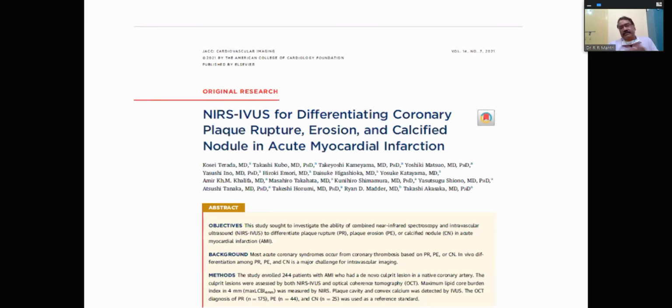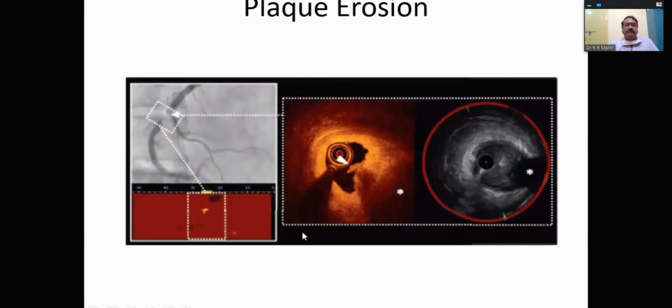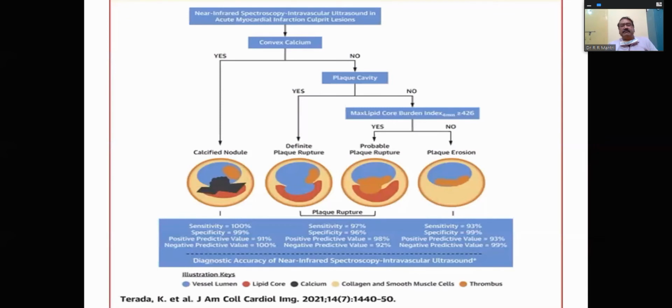Then three things were combined in this study, published recently: near infrared spectroscopy to look at the amount of lipid, IVUS and OCT. And they have come out with certain criteria that in plaque rupture, within a 4 millimeter segment, there is a lot of lipid, and there is a communication between intima and the media. Then in plaque erosion, you don't see much cholesterol, very small amount of lipid, predominantly thrombus. And in calcific nodule, again, the lipid amount is very small, and it is predominantly a calcific lesion. And these are the criteria they have given.